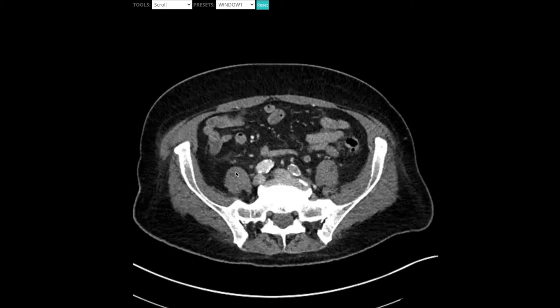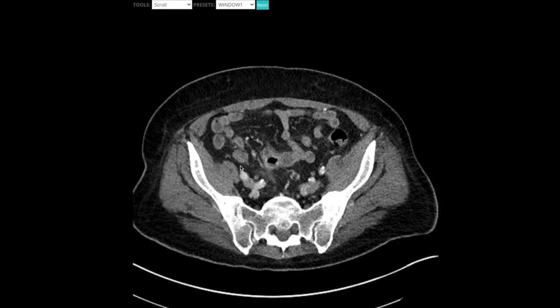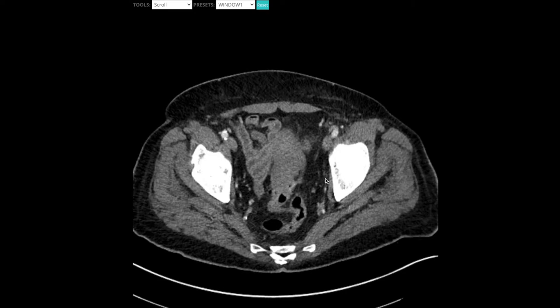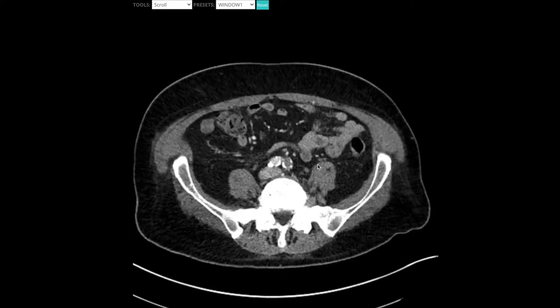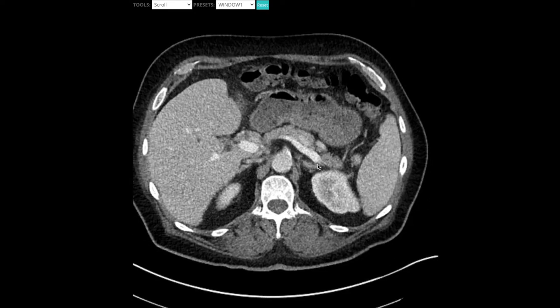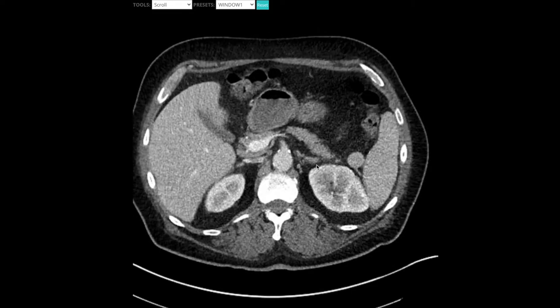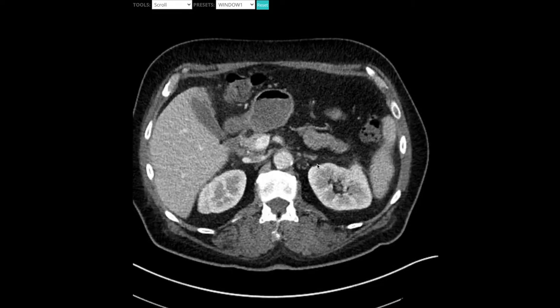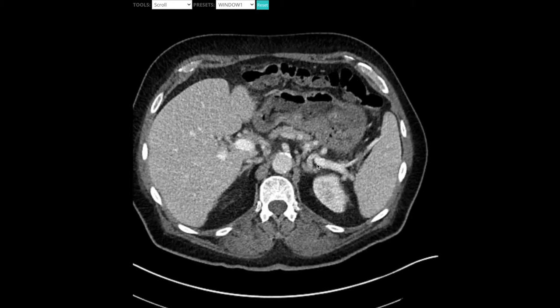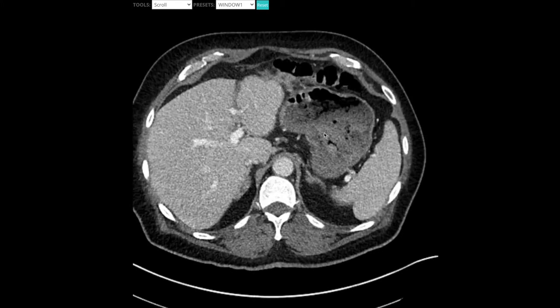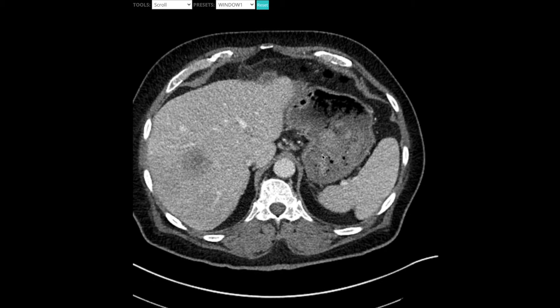Just in terms of size criteria: small bowel is three centimeters in diameter as the upper limit, colon is six, cecum is nine, and sometimes people use twelve for the stomach. Those are just general numbers to keep in mind.